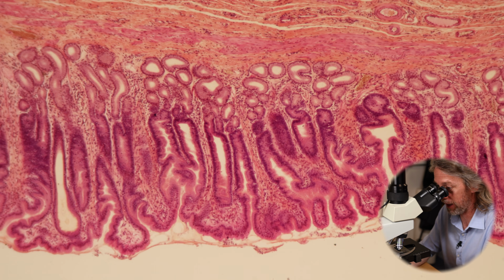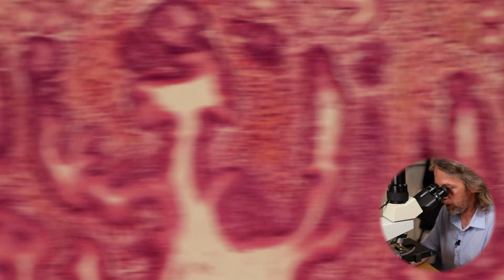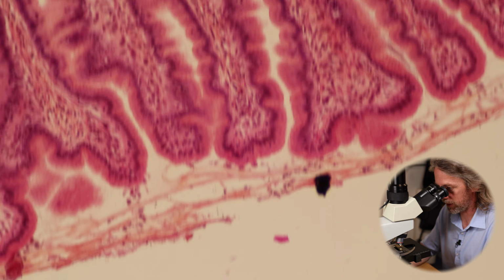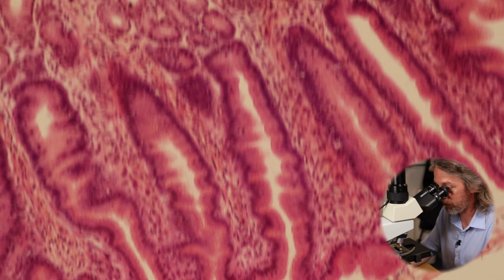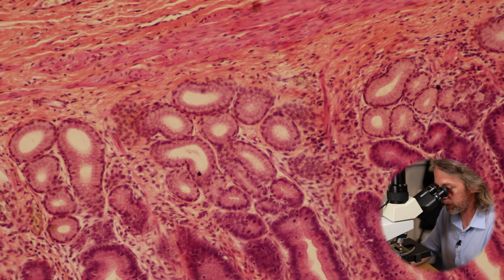They look different here. We haven't got loads of those cells packed together. We're not seeing the tubular shape. Here we get to see the tubular shape. And then we see the gastric pits. Jump up to a higher power. Okay, those gastric pits. Isn't that just a beautiful section? There's the surface of the stomach there. There's a mucus covering to it again. We're seeing that simple columnar epithelium, and we're seeing that fold down into the gastric pits, these tubes here. And then as we get down here, look, there's the gastric glands.